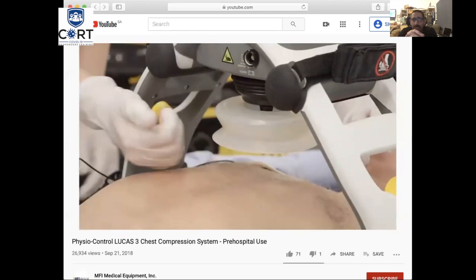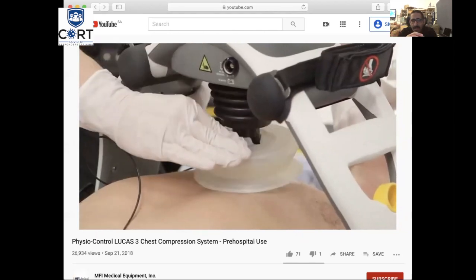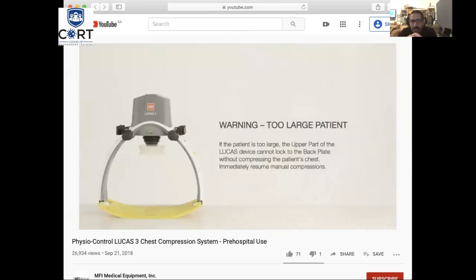So if it's not better or worse, why should I invest? This is almost 70,000 riyal. Why should I invest 70,000 riyal in this machine? It does save energy, definitely. It does save energy.